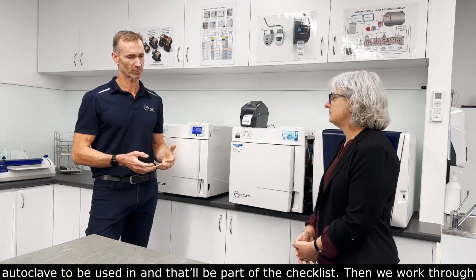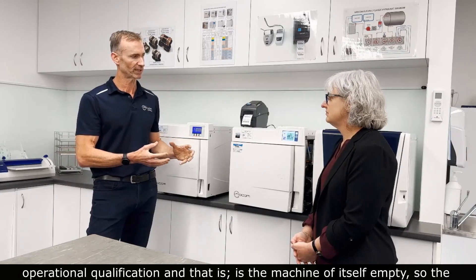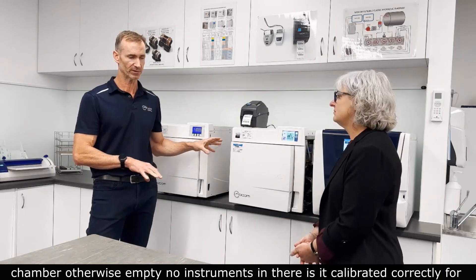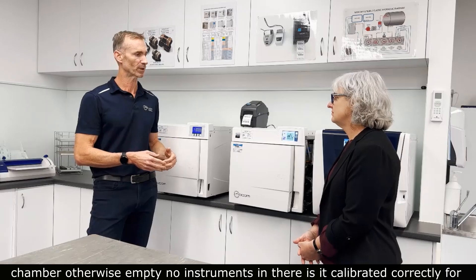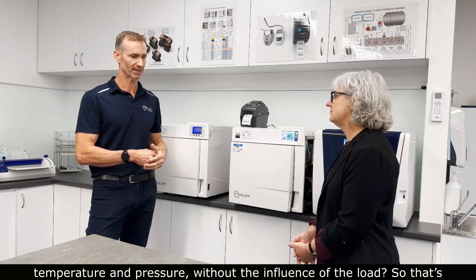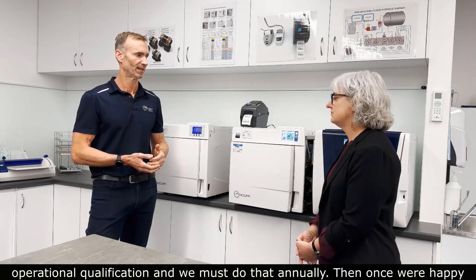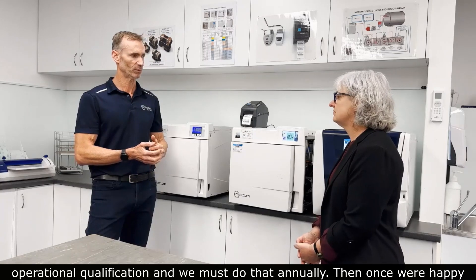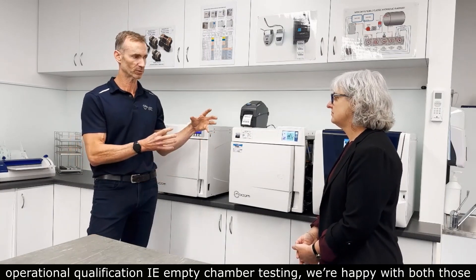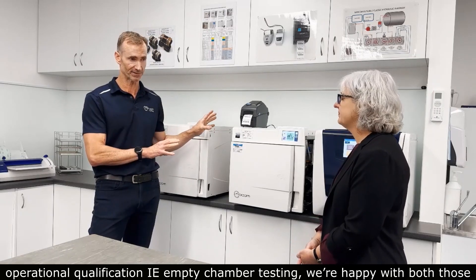Then we work through Operational Qualification — that is, with the chamber empty and no instruments in there, is the machine calibrated correctly for temperature and pressure without the influence of a load? That's Operational Qualification, and we must do that annually. Once we're happy with the preventative maintenance and the Operational Qualification — i.e., empty chamber testing — we roll on to Performance Qualification.